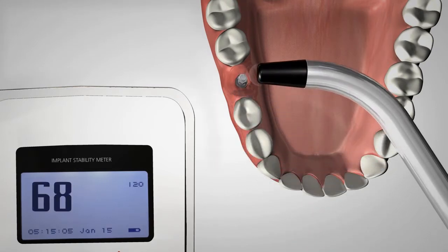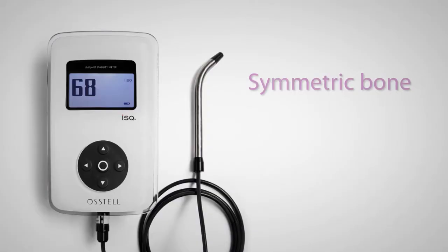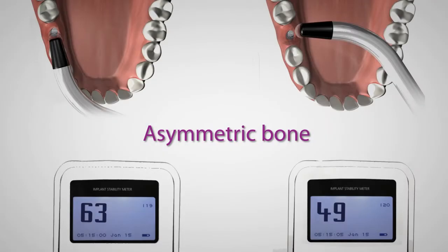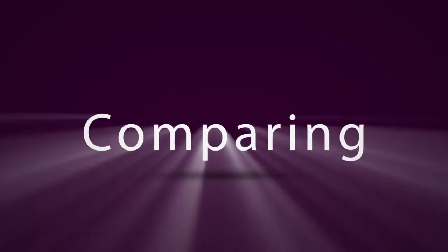A second reading is taken perpendicularly to the first. In symmetric bone, the two values will be about the same. If the implant is placed in asymmetric bone, the instrument will display the highest and the lowest stability value. This completes the ISQ measurement for implant stability.